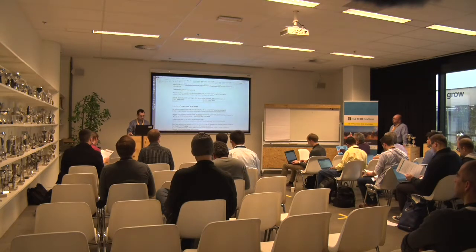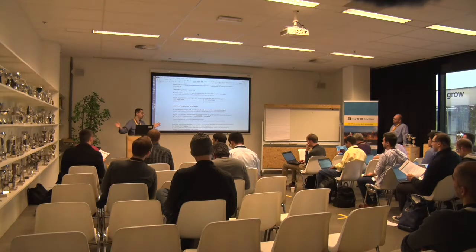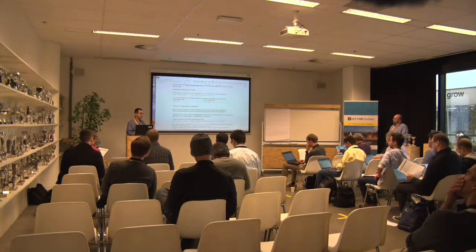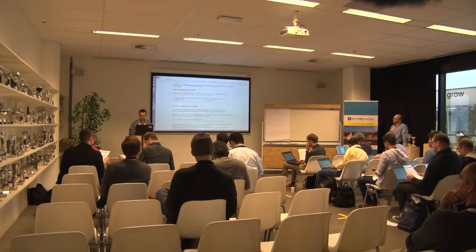Okay. Oh, and of course, the dataset is also separate from the service. The dataset is open source on GitHub. You can go take it, install it on your own FHIR server, your own DICOM server, test with it, play with it, contribute if you can. It's actually developed by radiologists, so that's one of the reasons why it's very realistic.